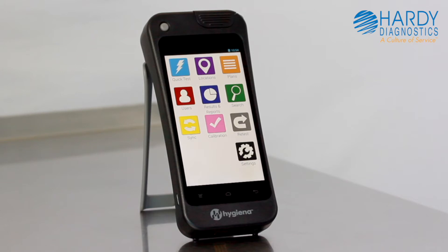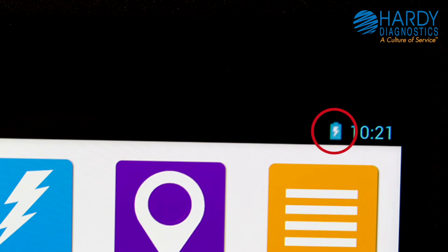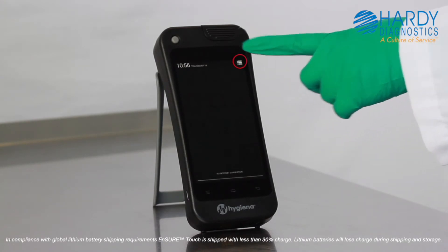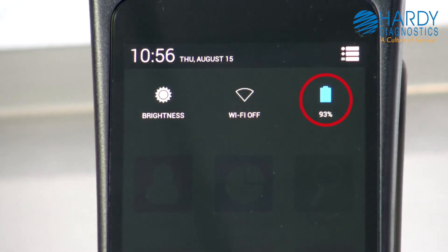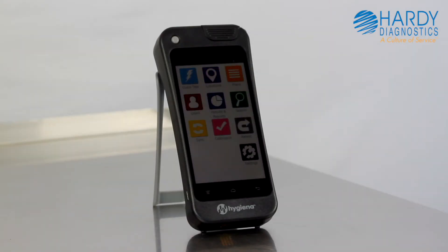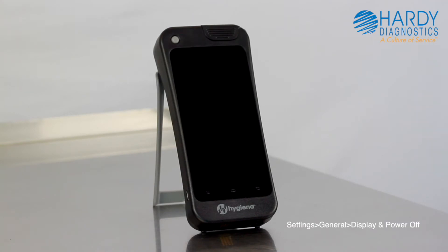When it's on, you can monitor the battery level in the top right of the screen. When charging, there will be a thunderbolt inside the battery icon. To see the battery percentage, swipe down from the top of the screen and touch the square quick settings icon at the top right. To optimize battery life, Ensure Touch will go to sleep after a period of inactivity. You can modify this in settings.